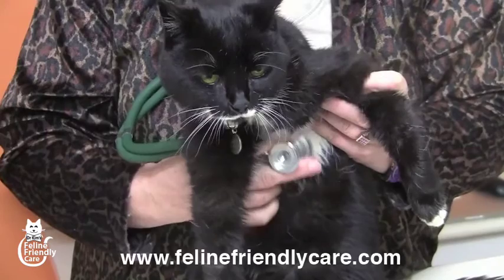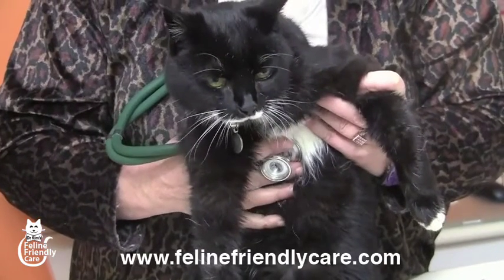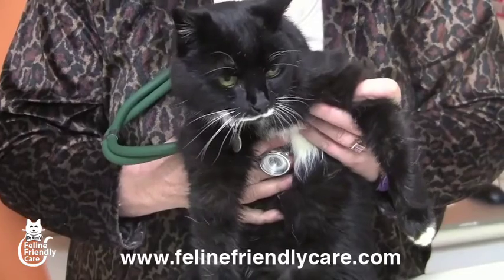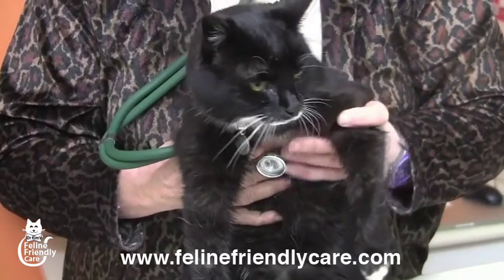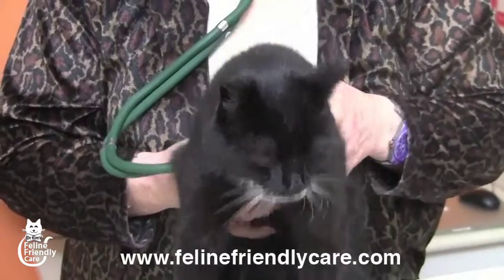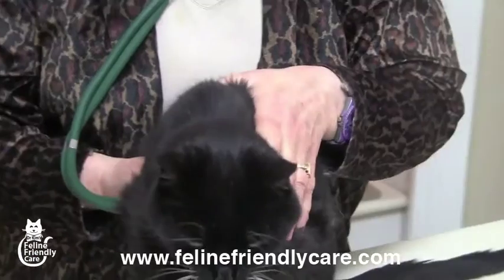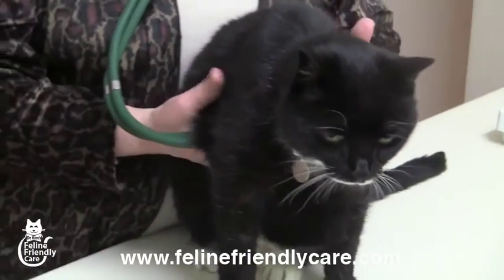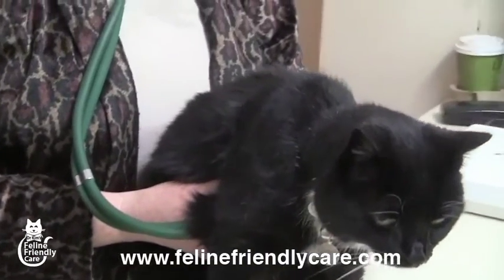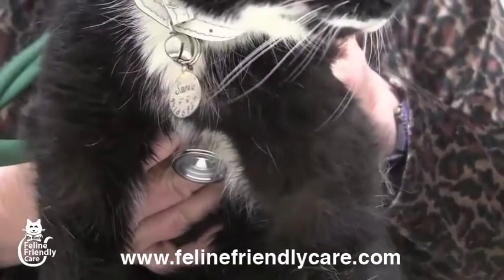This is not the position to listen to the heart, because it changes the position of the heart in the chest. This is just to show the location of the stethoscope. Just gently hold the stethoscope there. If you press too hard — particularly if you can press the chest crossways — you can create a heart murmur, which is not something you need to do. Cats have enough heart murmurs on their own.